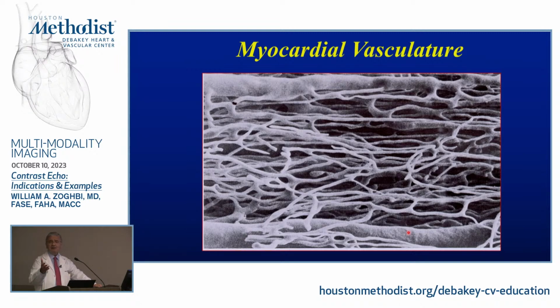You're going to bombard these microbubbles that are moving just very tinily and exposed to ultrasound. You're going to destroy them, right? So you have to do something different to be able to see when contrast goes into these capillaries and venules, to be able to preserve it, right?